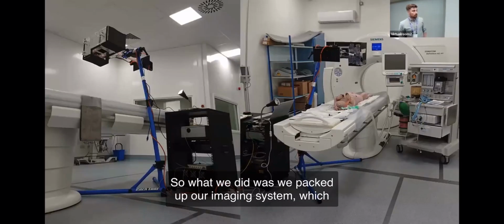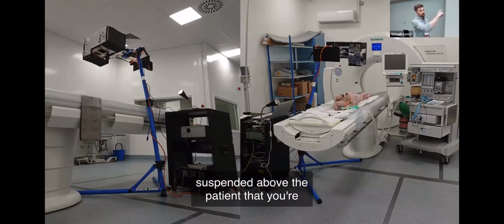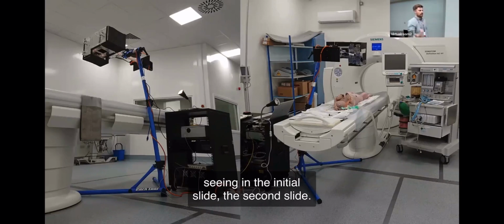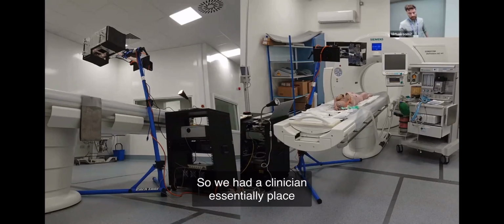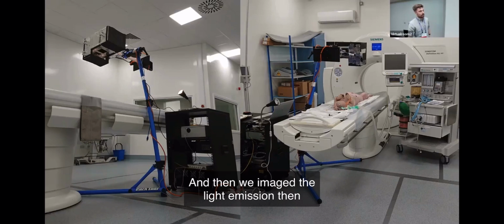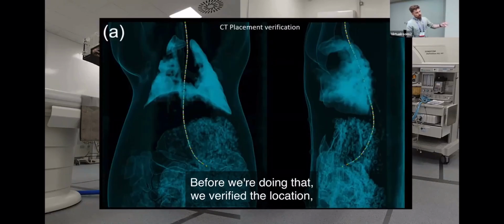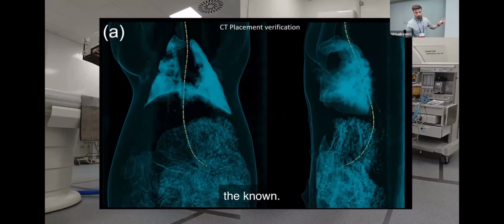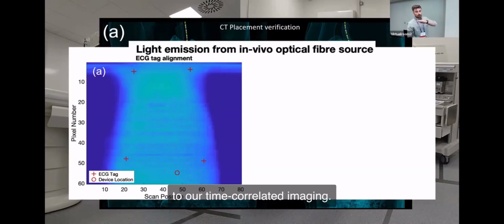So what we did was we packed up our imaging system, which was a bit of work in itself. So that's the actual imaging system suspended above the patient that you've seen in the initial slide or the second slide. And we used a porcine cadaver model to test this. So we had a clinician essentially place a fiber optic probe within the stomach of the pig, and then we imaged the light emission on the surface of the patient. Before doing that, we verified the known, let's say, ground truth spatial location of the light source using CT imaging. We then compared that and aligned that to our time-correlated imaging.